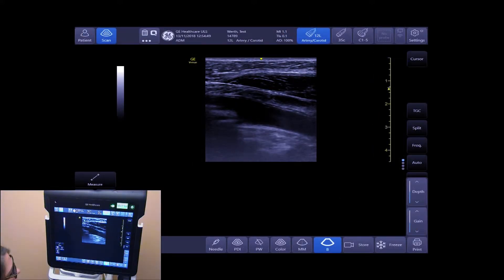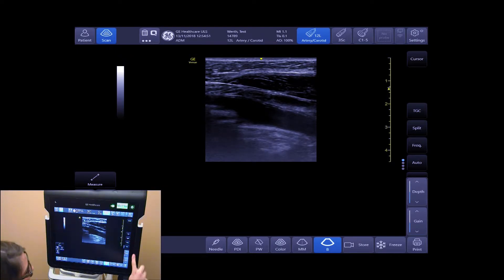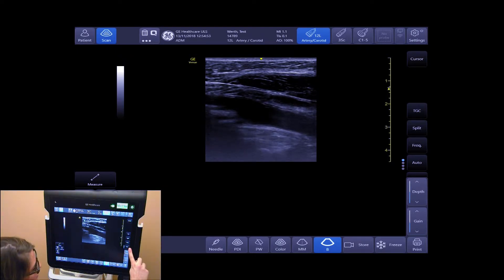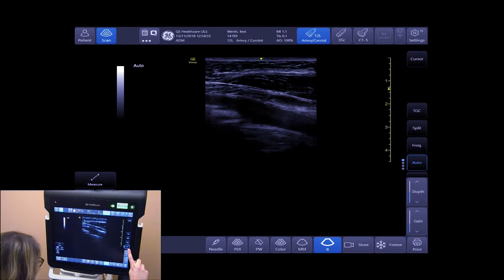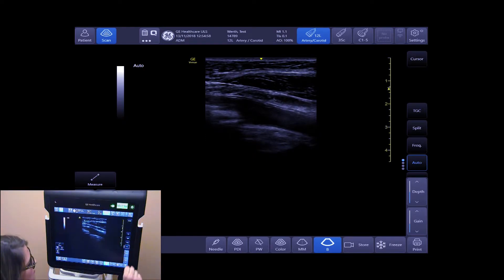To auto-optimize your image, tap on auto on the right-hand side of your touch screen. This will improve your contrast and your grayscale.